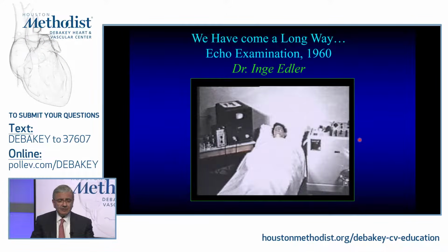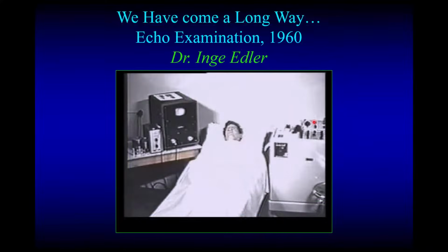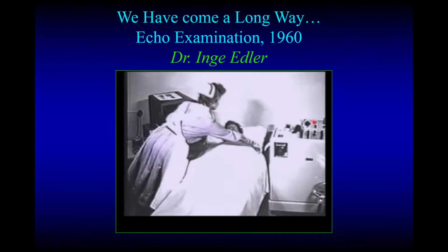And I wanted to leave you, and I usually do that, with this video. This is from Dr. Inge Edler. He's from Sweden. He was at the University of Lund, and this is an echo examination in 1960. So we're talking, a few years ago, and really amazing as to how much this technology has evolved over time.